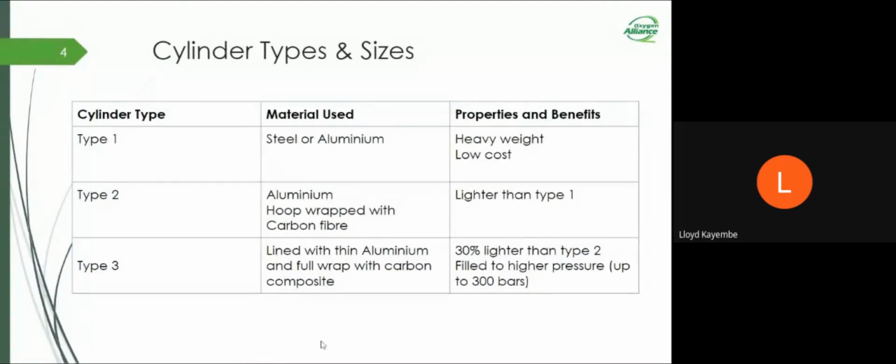Yeah, so following up that question on MRI compatible cylinders, Bernard is asking, what material are the cylinders exactly made of? There's another hand raised by Erison Bajinga. So I think Erison, you can come off mute and ask the question. Then Masanja Baluya can ask also after Erison.